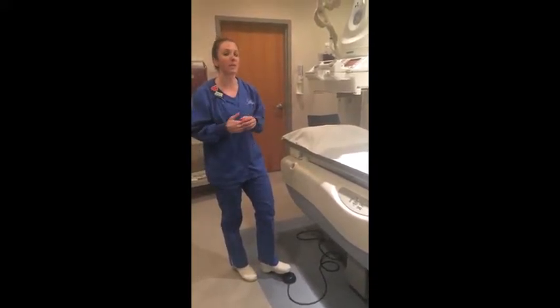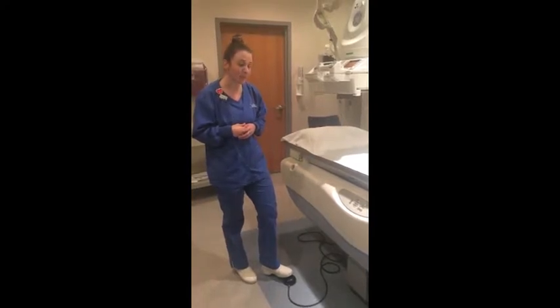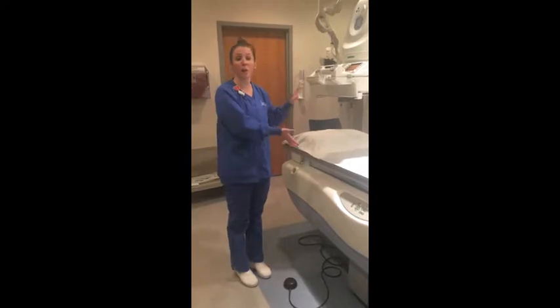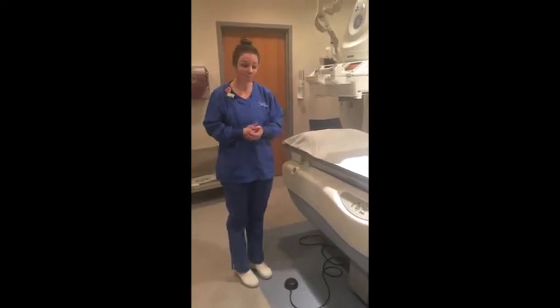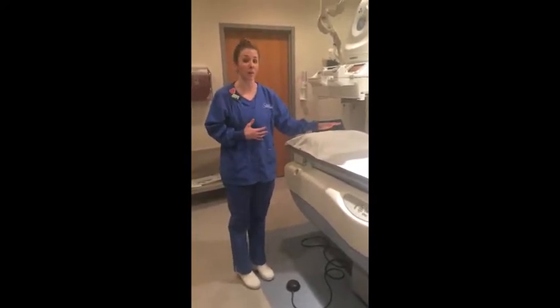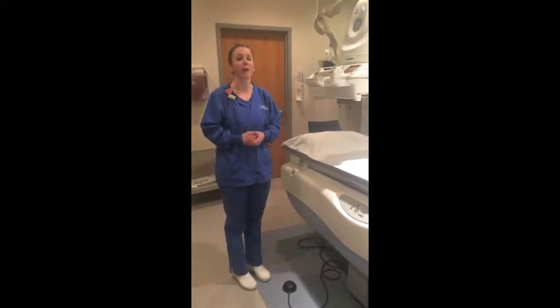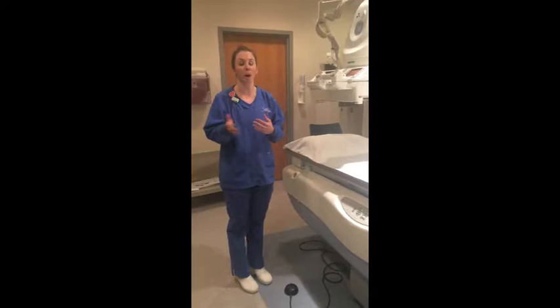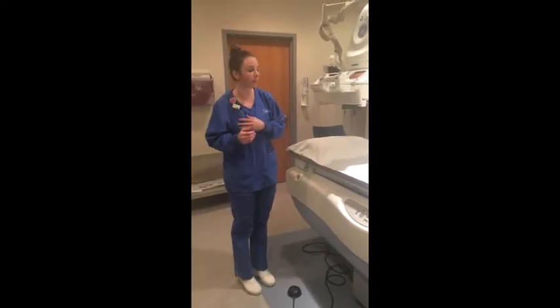So by pulsing, we mean when the radiologist steps on the foot pedal, it will turn on and record a live feed, kind of like a movie of whatever the radiologist is doing. Okay? When they take their foot off, then that stops the recording and creates a loop, which Holly will go further into depth later.